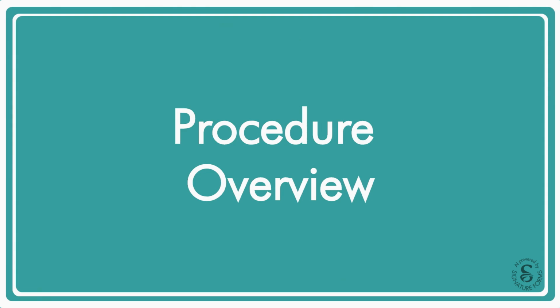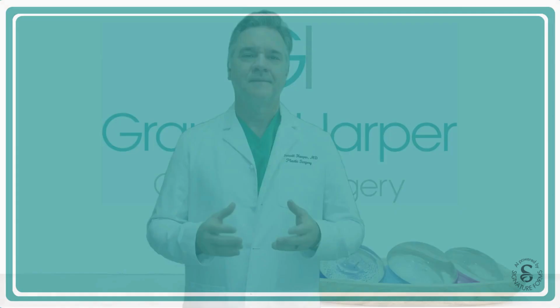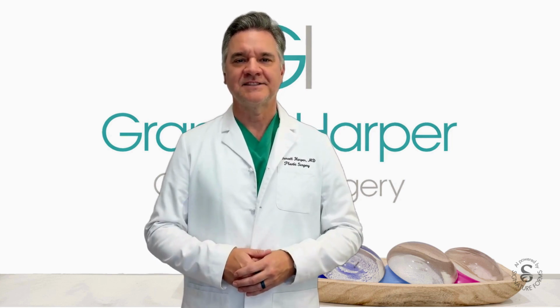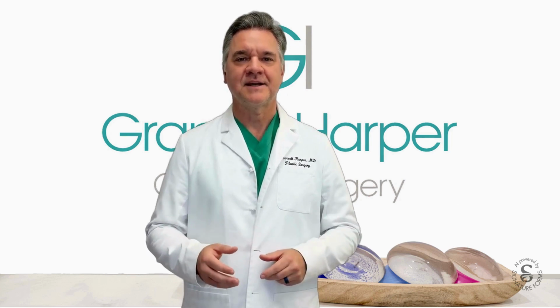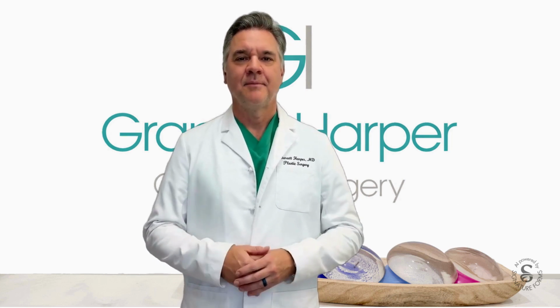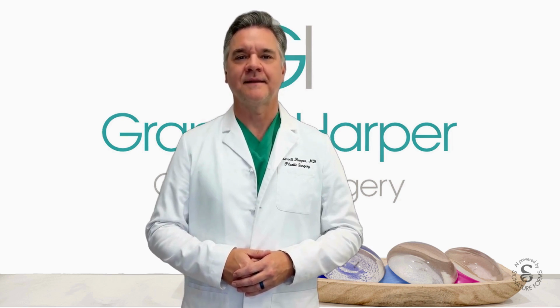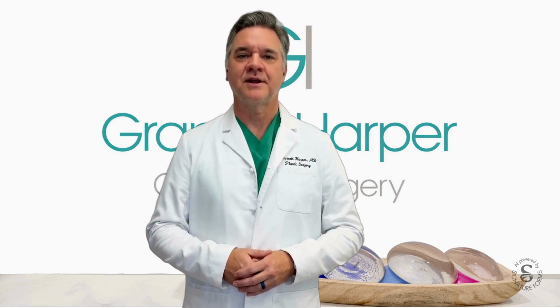Now, I want to walk you through what generally happens during the procedure. During surgery, I open the area around the implant, address the scar tissue capsule that has formed, and remove or release it as needed. I then place a new silicone implant, and in some cases, I may reshape the pocket so the implant sits in a better position. Depending on your anatomy and your goals, I may use a different incision than the one used in your original surgery. If the tissue has stretched or if there is looseness in the skin, some patients may also need additional support procedures such as internal pocket reshaping or a breast lift. The exact plan depends on what I see before surgery and sometimes what I find during surgery as well.